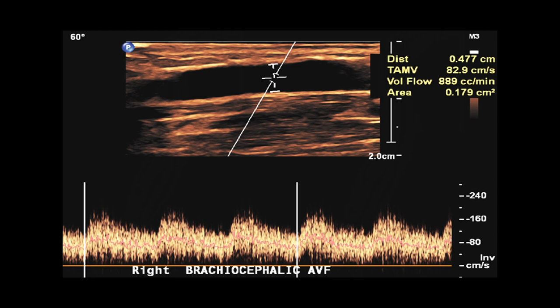Lastly, use the Doppler waveforms to measure volume flow in the mid-outflow vein. This image shows volume flow displayed for a brachiocephalic fistula.